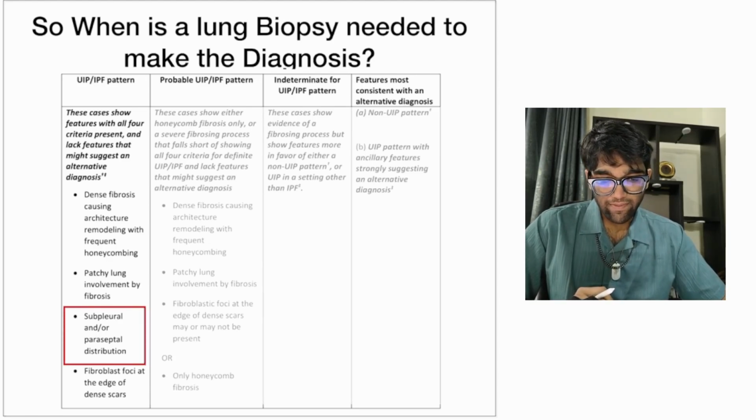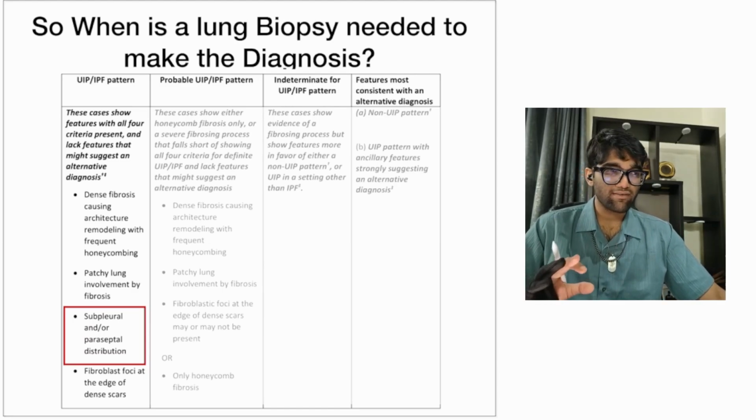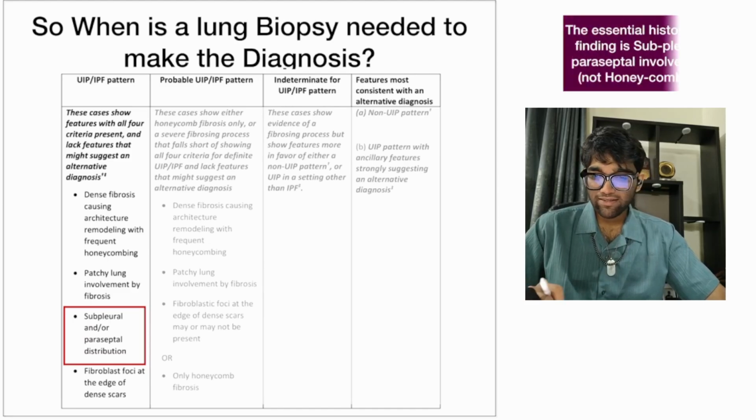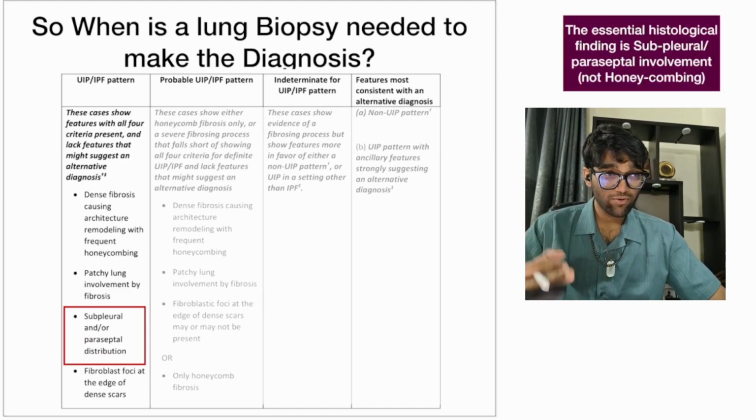Okay, that is when, okay, actually there is no situation in which you do it. You do it when, okay, so I wanted to highlight something else.